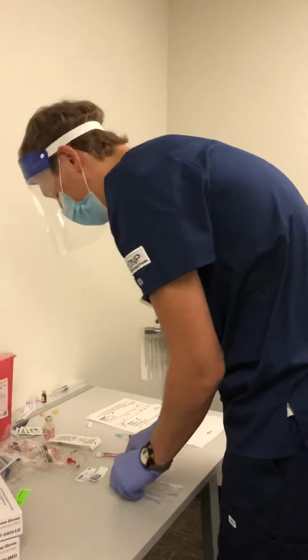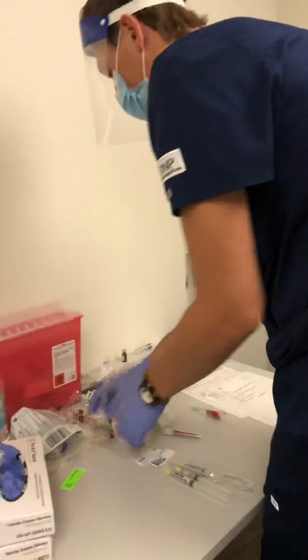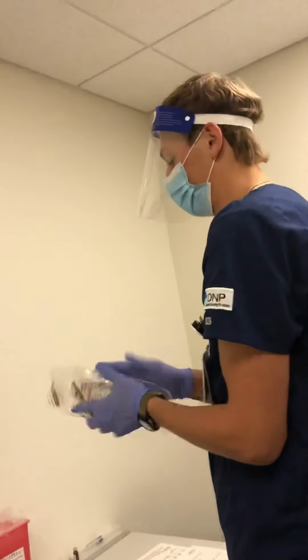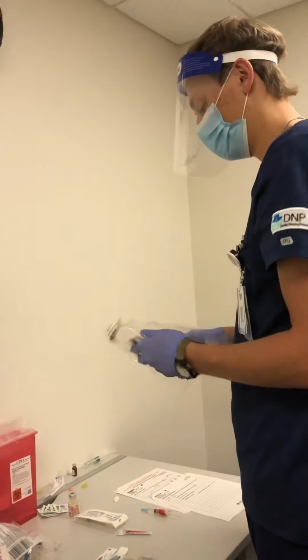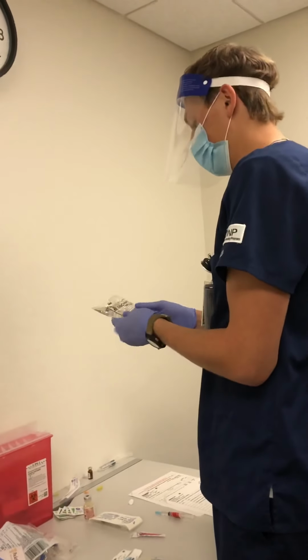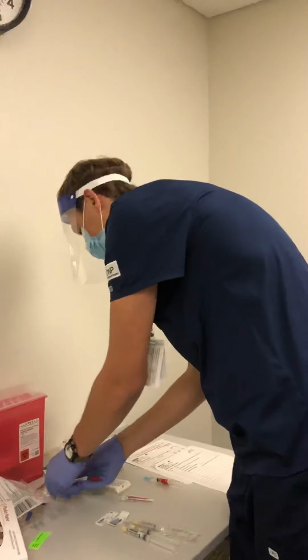Okay, so now I can move on to my saline mixed with potassium chloride. I'm going to start off with the normal saline. So this bag hasn't been tampered with or anything. There's no leak, so I can go ahead and open it. Okay. And toss that. There's no particles in here or anything. It's not cloudy or off color or anything like that. So I should be ready to go with that.